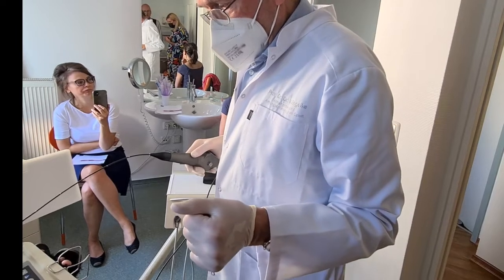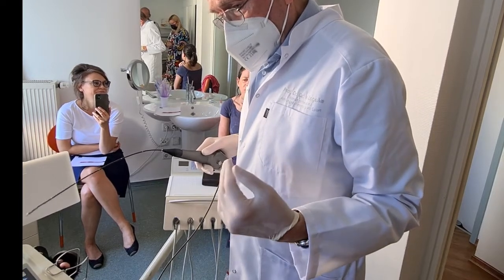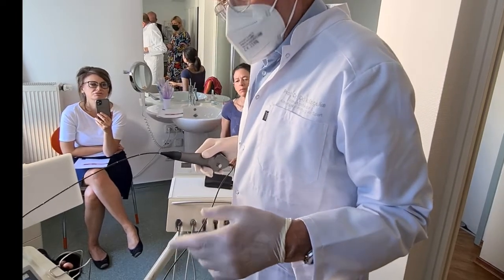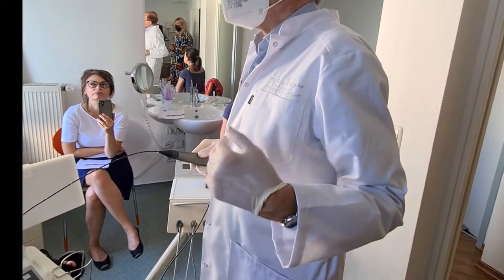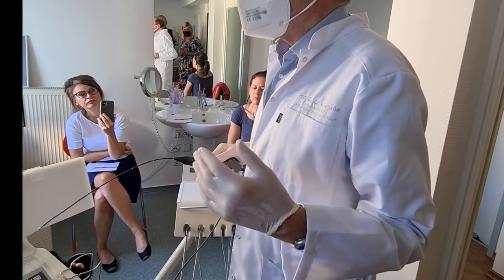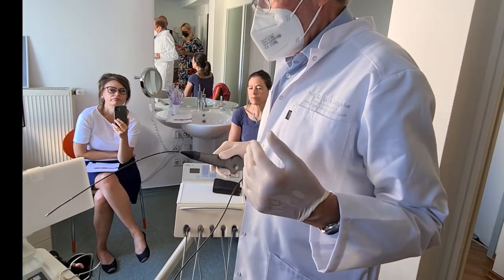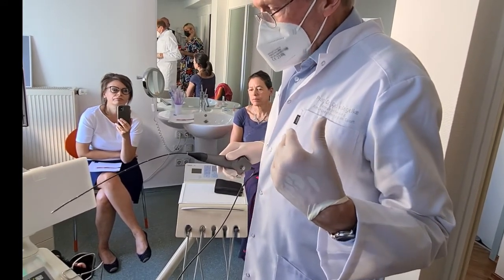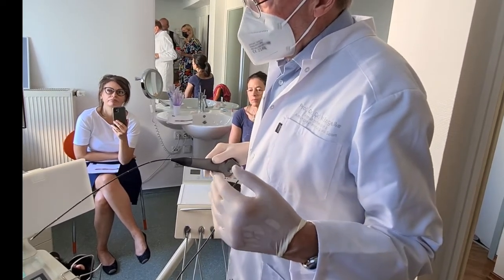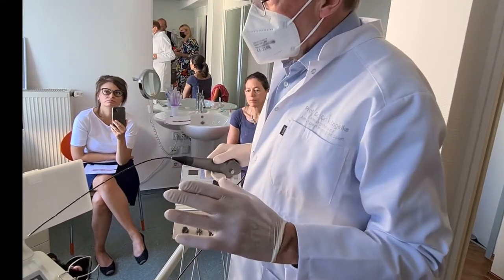So the effect which you will have from the splint will be possible when using a maximum of protrusion. With the splint, this could be shown during the protrusion, the airway reacted very well to the protrusive action. So I suggest that this splint should be activated with strong elastics just for 2 or 3 millimeters more, to use the protrusion instead of only leaving it in the mid range. Okay.